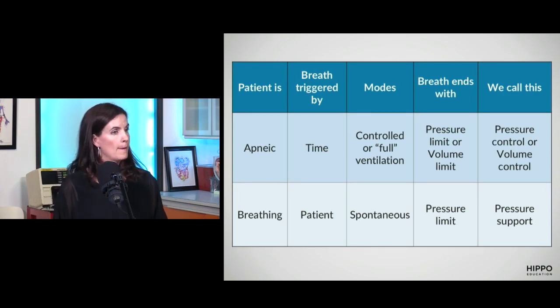And so volume, I get it, like I'll be like, oh, you take 600 milliliters of air. That's the volume that's going to go in your lungs. The pressure is that end pressure, just how much pressure at full expansion of the lungs. Is that like what you're talking about in terms of pressure? Absolutely. So the vent is blowing air in and it's measuring the pressure that is entering your lungs. And when it gets to the limit you've set, it stops. All right. And as the bag fills up, the pressure goes up, up, up, stop. Exactly. Same concept as blowing up a balloon. But in general, with the lungs, your volume and your pressure are going to go up and down together. They're going to track linearly.